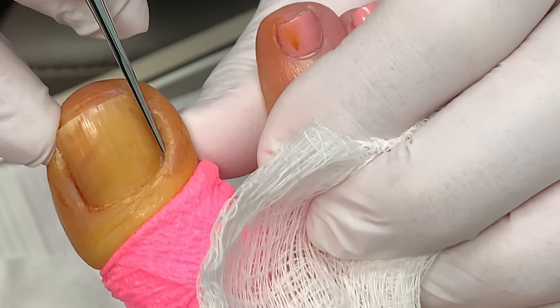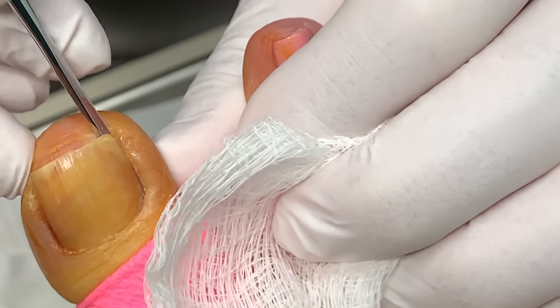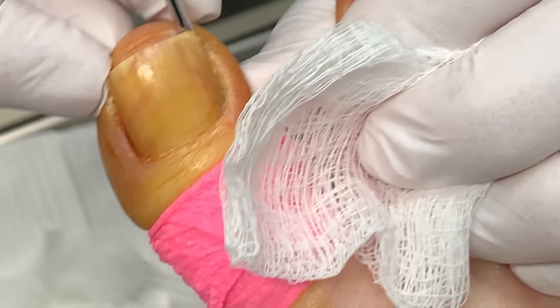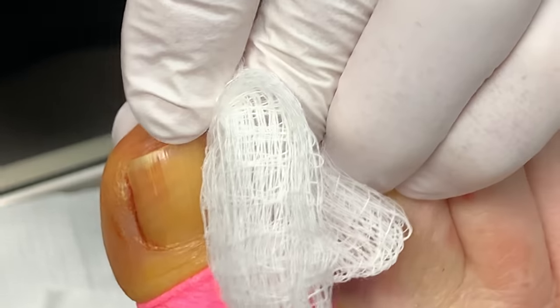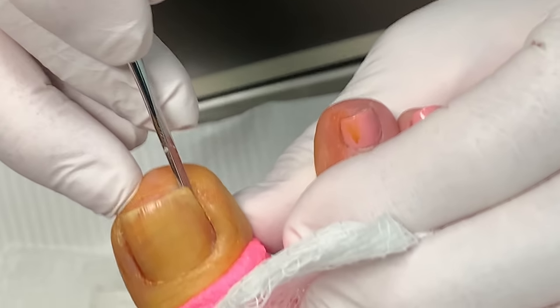This is the scream test. Any pain? No scream. No? Any pain? No. Okay, cool. But this side never hurts you, right? Yep. Okay, cool. Let's do it.